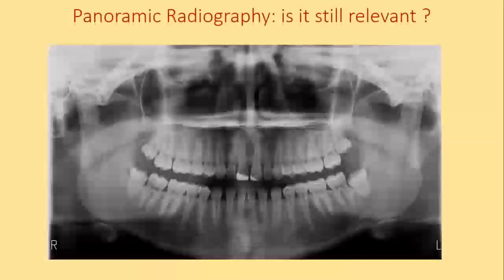Very honestly, even today, I should very shamelessly tell all of you, I like to look at my pans. I like it because it gives me that screening image. It's a good, nice screening radiograph. I have a CBCT, but still I'd say, can I see a pan once? The CBCT machine does give you a better pan than this, but as academicians, you want to hold that film, somehow. But is it relevant? Let's answer that question. So that's a good pan.